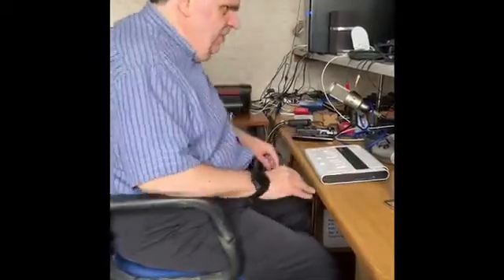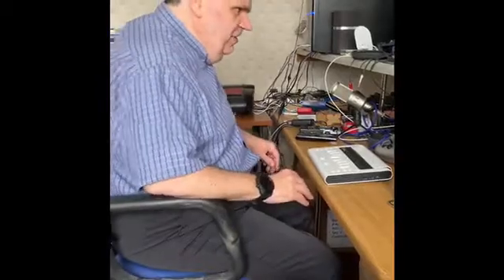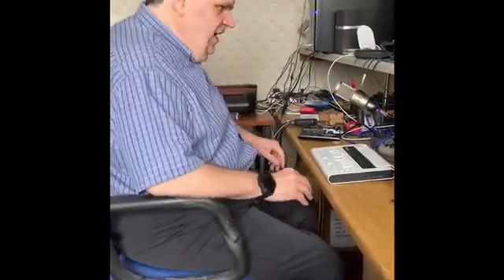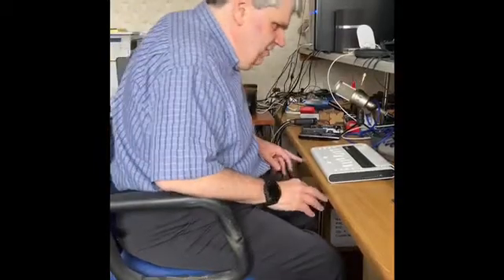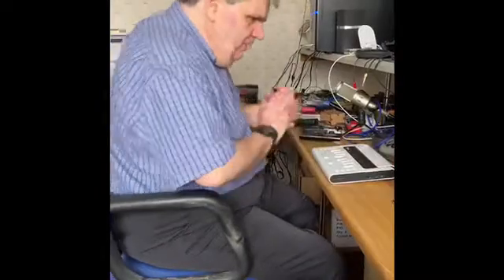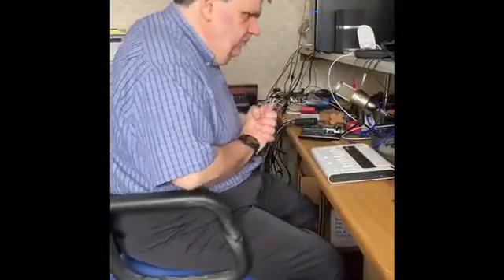So Esytime is the environment I'm in at the moment, and it's its own word processor, just like the Polaris and the Braille Note Touch. It has its own word processor, it has calculator, it has tools, it has internet, and all of that stuff. And it has Braille, of course.